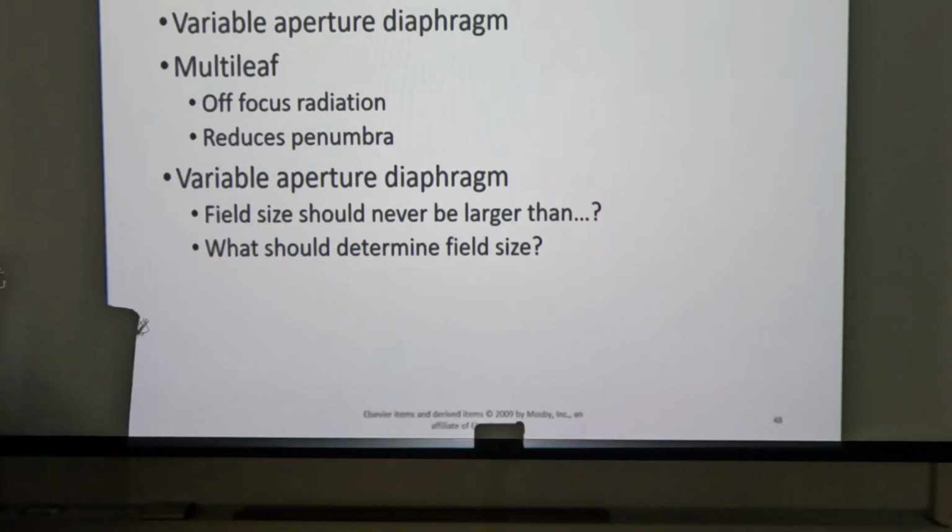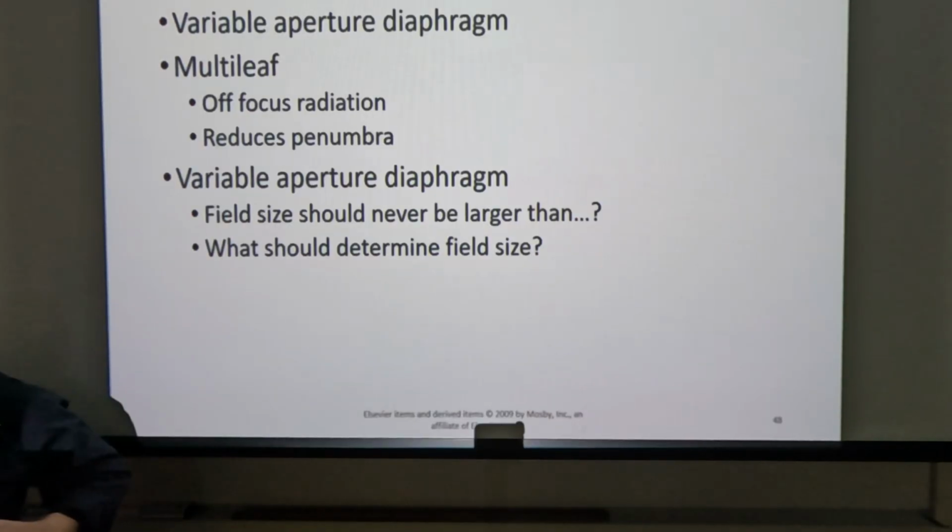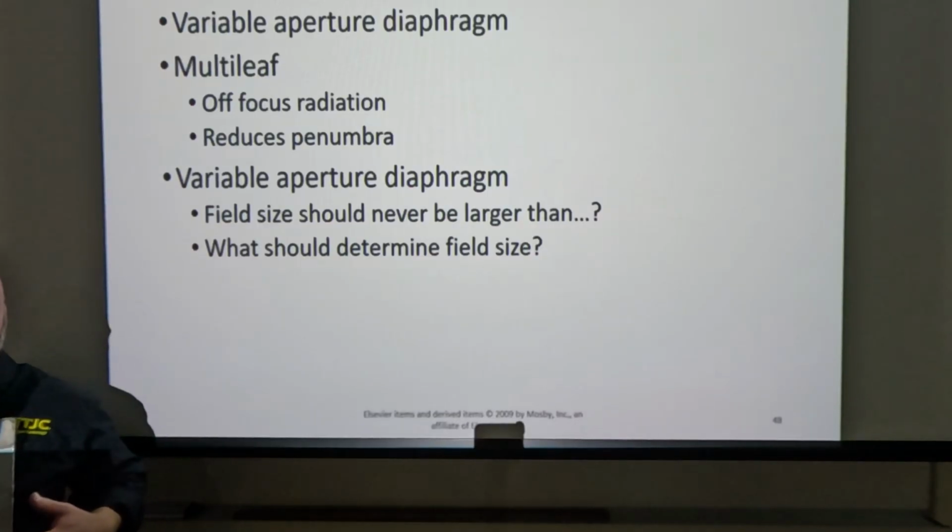But if you find yourself working in an institution where the image receptor is this size, maybe a pediatric little place, and then you get one of these baby Huey kids that comes in, you're doing a chest x-ray on them. Are they going to fit? The answer is no, they're not.